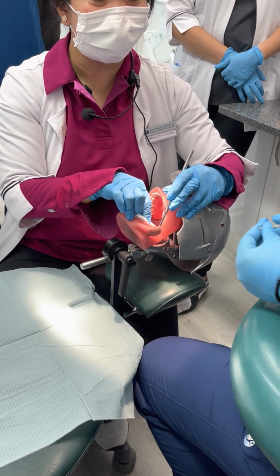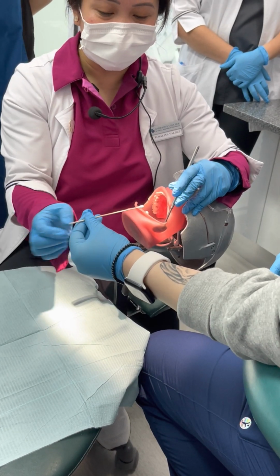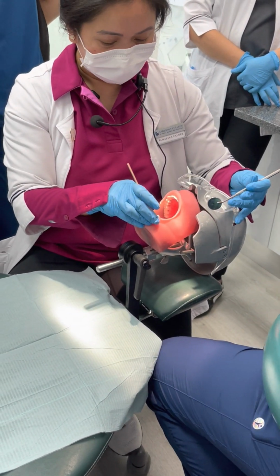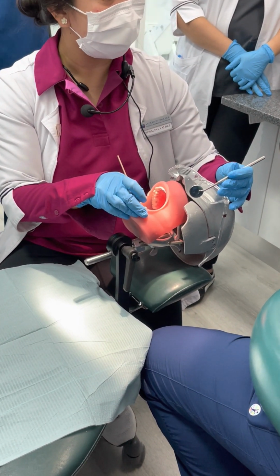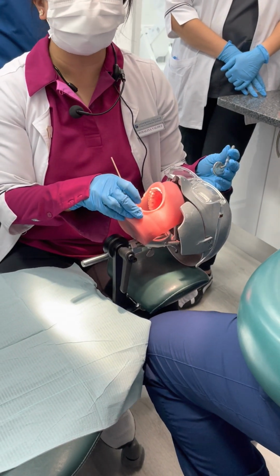You're drugged enough already. So you give me that topical, then I'm gonna pass this. Give me this. Now what's next? Syringe? After that, injecting. Get it ready, the syringe. Assemble it, passing local anesthetic. Now this is why I asked you to know how to assemble this.